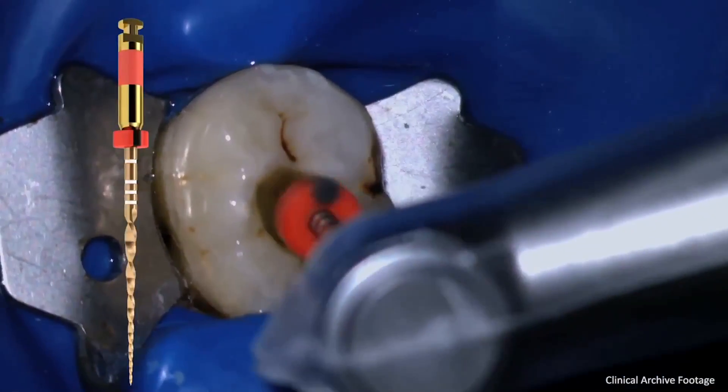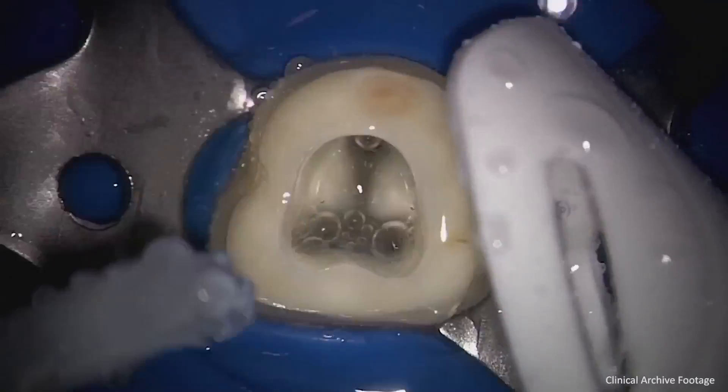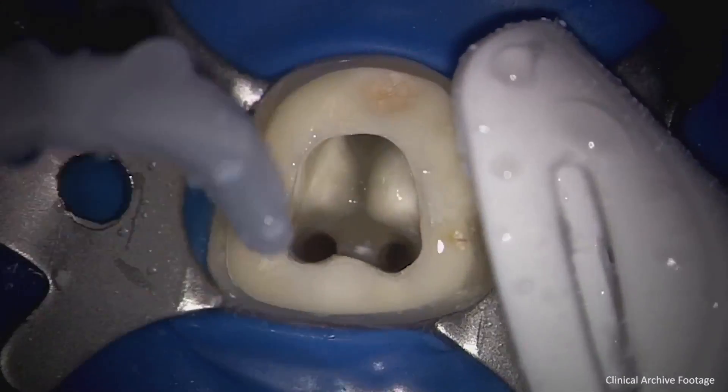After the three main canals are treated, the second canal in the mesial buccal root is located and instrumented. I wait to explore for the MB2 canal because I think this canal is easier to find after the final shapes are obtained in the three main canal spaces. At this point, the road map inside the chamber that directs the search for the MB2 canal is most accurate. This sequence also allows more time for sodium hypochlorite to be deep in the three main canals because the final shape has already been achieved.